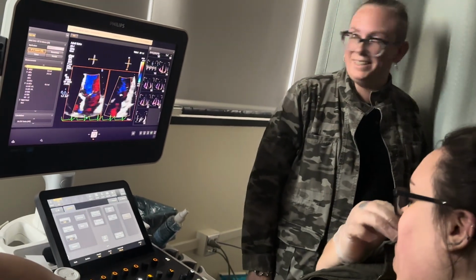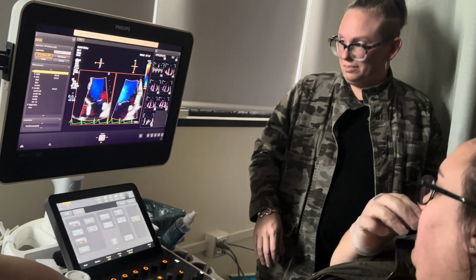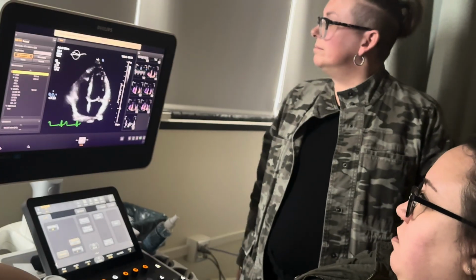Would this be something you would use on like a myxoma? Yeah. Yep, that's exactly it. All right, anything else y'all want me to show you?